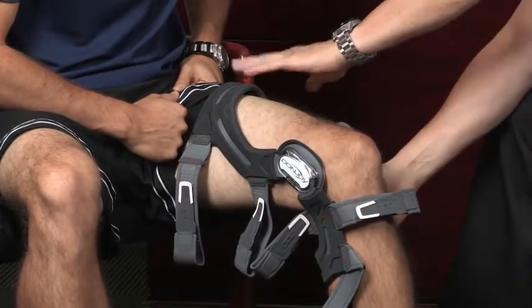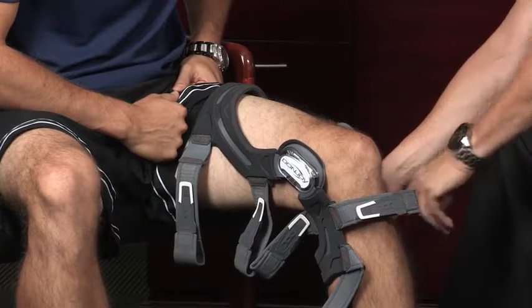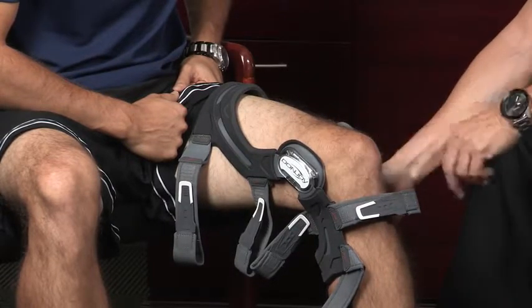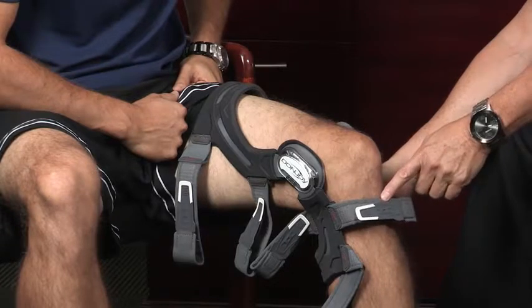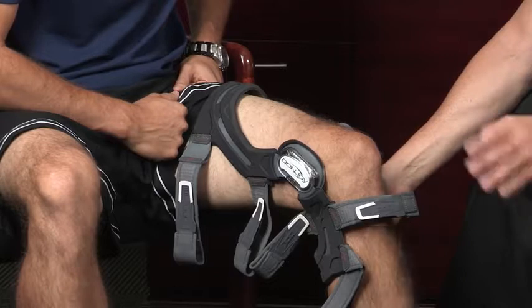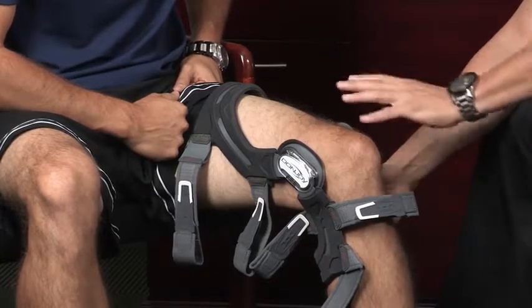You get that placed properly, you have your calf cuff right here. You have a frame with an anterior cuff and a posterior cuff — that's called the four points of leverage. This whole strapping system is designed to reduce strain on your ACL, and it keeps the part of your leg called the tibia from moving forward. That's what reduces the strain and helps protect the ligament.